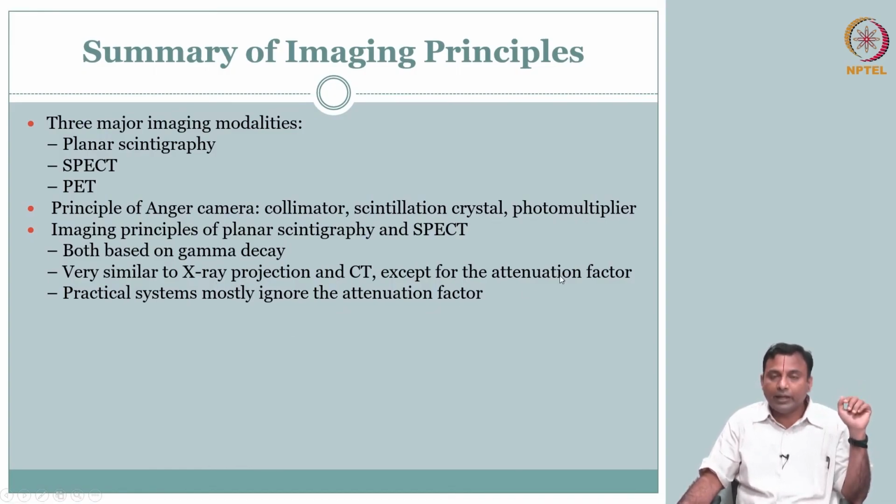We could ignore the attenuation factor, which is routinely done, right. In most practical systems the attenuation factor is ignored, but we also see that it is an active area where you could do corrections.